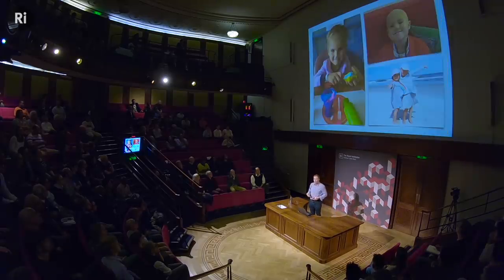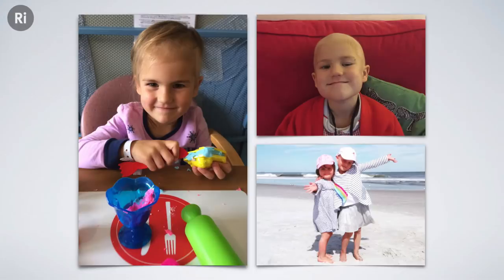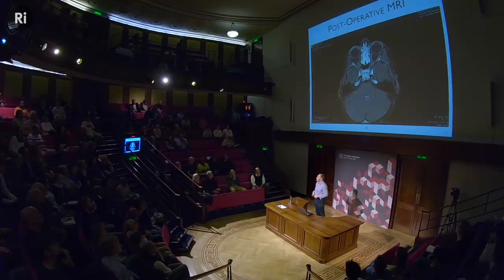That's an MRI scan through Snowy's head, and you can see very clearly the tumour that's growing around her eye. Now, fortunately, the surgery was successful. It's quite difficult to see in that post-surgical picture on the left which eye it was that had the surgery. And Snowy and Posy seem to be reasonably happy about the outcome. If you look at the post-operative MRI, you can see visually there's no evidence of the cancer remaining.